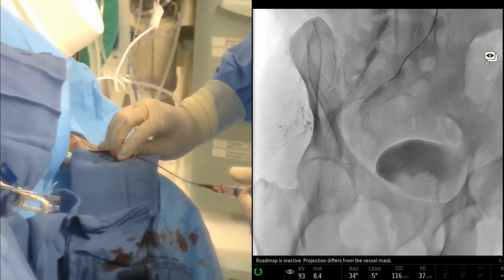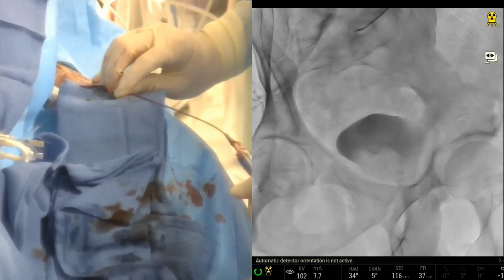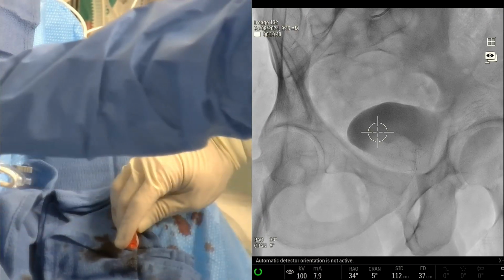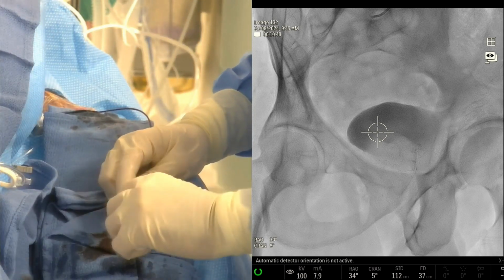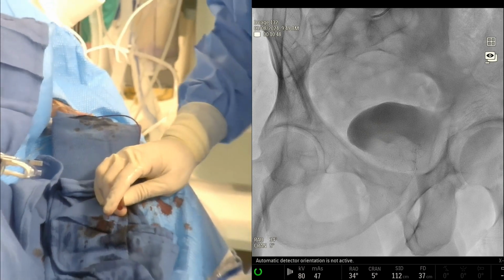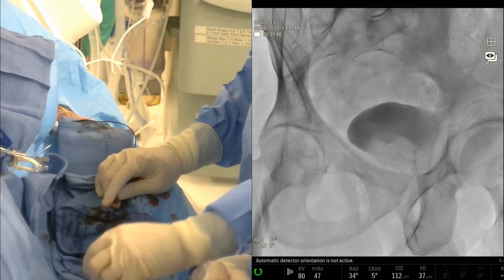Yeah, I mean, I think the low-hanging fruit, when somebody's watching this and they say, all right, I want to start doing more on the spectrum of urodynamics, you don't need full urodynamics, but again, the post-void residual and the uroflow, they're not expensive, they're easy to do, and they provide you with, I think, the two most important pieces of information as a baseline. Yeah, and to be able to do that yourself in the office without having to go see a urologist. Exactly. Particularly if they don't necessarily need a urologist for this. And so if you really want to do PAE, I think at high volume, you really need to be an expert in BPH. And to do that, you have to be able to take care of them clinically.